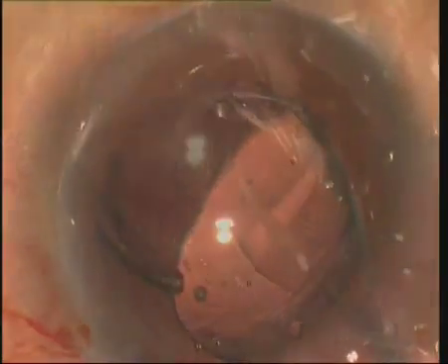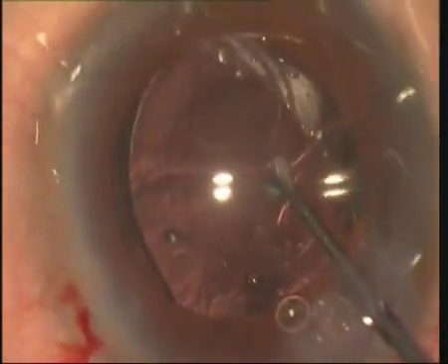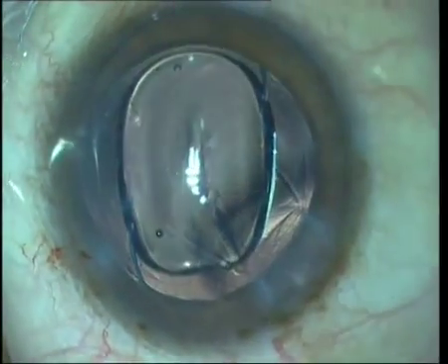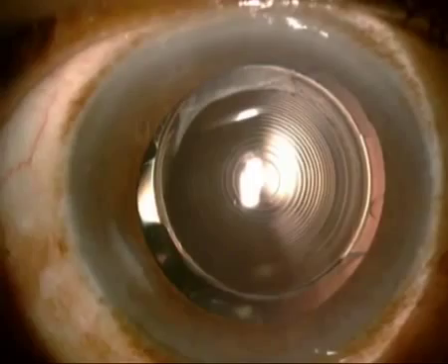We also know that patients with monofocal IOLs have traditionally been more satisfied with their visual outcome with regard to post-op blurry vision, halos, glare, and decreased contrast sensitivity. Multifocal IOLs have been associated with these symptoms despite uneventful surgery with the IOL well centered in the bag.